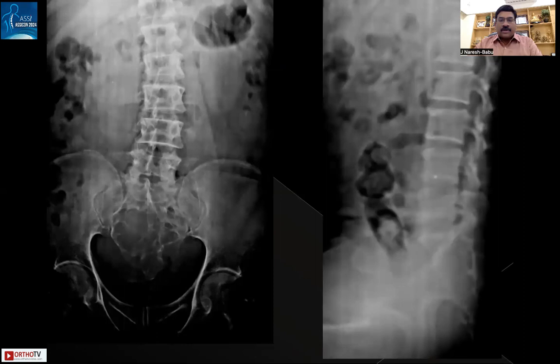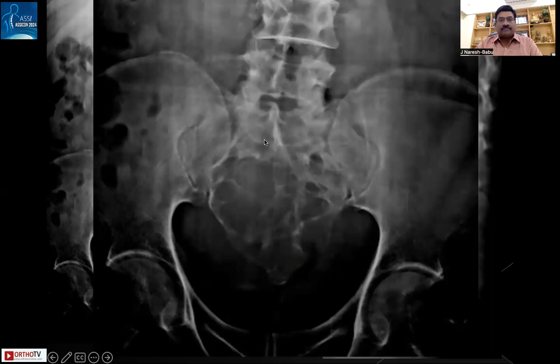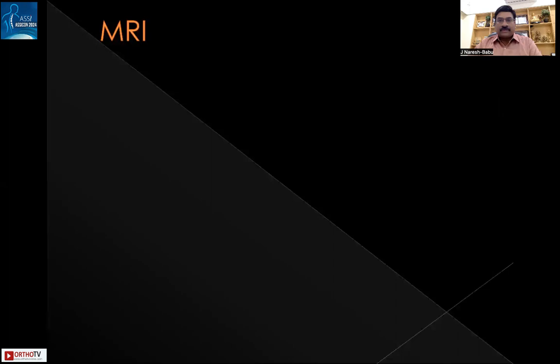These are the radiographs of the patient. You can appreciate the AP and lateral views. On closer look in the AP view, you can appreciate a huge lytic lesion at the distal end of the sacrum involving from S1 and S2 segments, with ballooning of the cortex and some breach in the cortex as well.